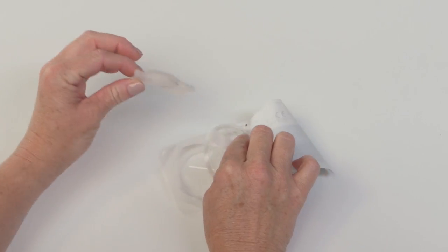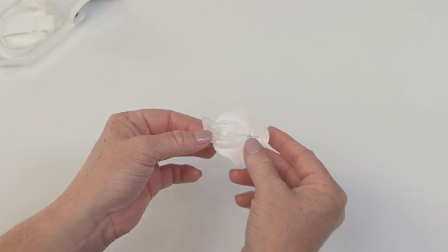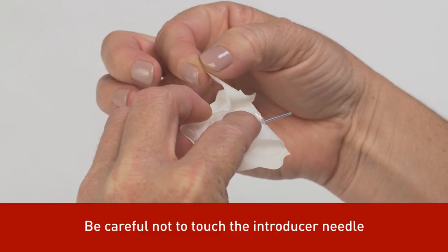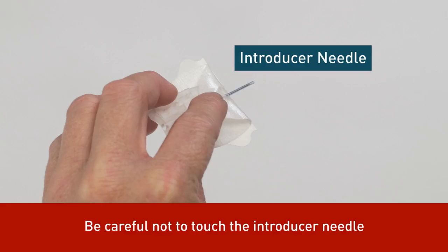First, remove the contents of your set. Hold the introducer needle with one hand while gently removing the front half of the adhesive backing paper with the other hand. Be careful not to touch the introducer needle when removing the adhesive backing paper.